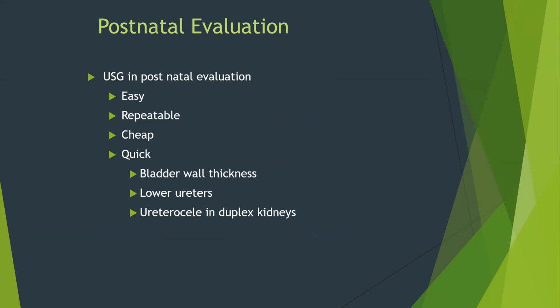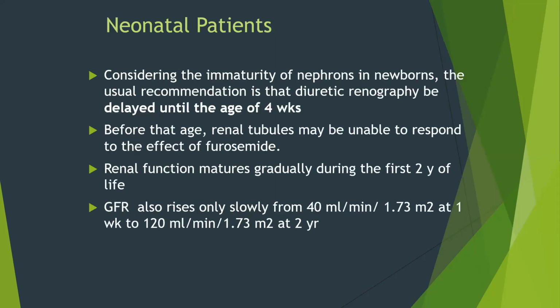In postnatal evaluation, ultrasound is very easy. It is repeatable, very cheap and quick. It gives us quick results. We can see the bladder wall thickness, we can see the lower ureters, and we can see the ureterocele duplicates.